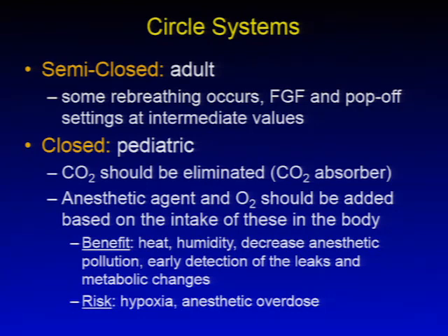And also anesthetic agent and O2 should be added based on the intake of these agents into the body. The benefit is to conserve heat and humidity, and it also decreases anesthetic pollution. It can also provide you earlier detection clues of leaks and metabolic changes. The risk of the closed system is hypoxia and anesthetic overdose.